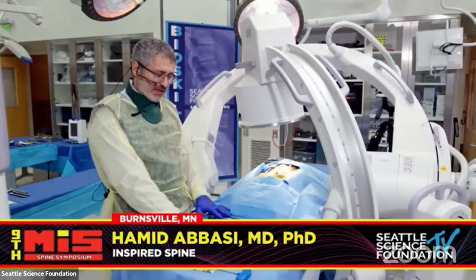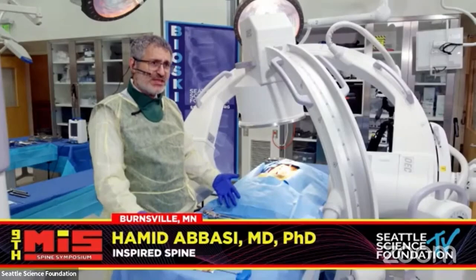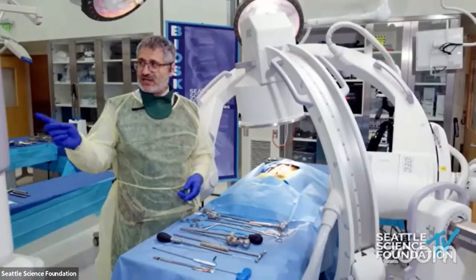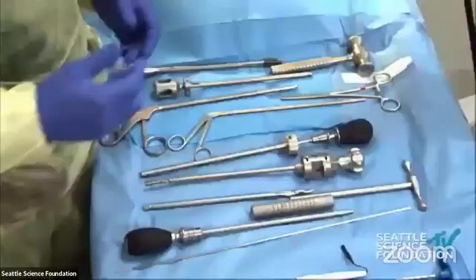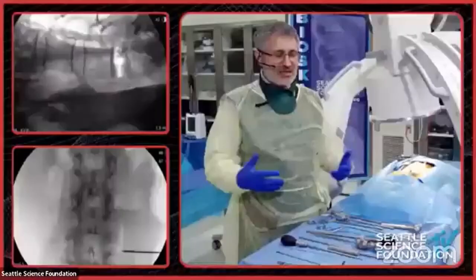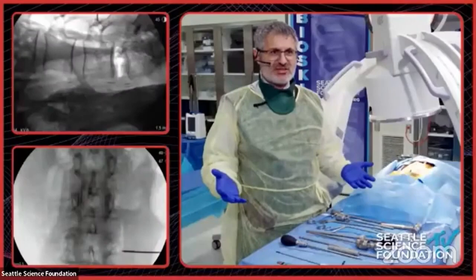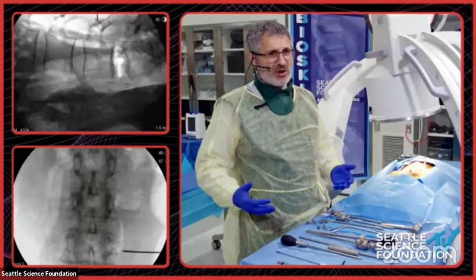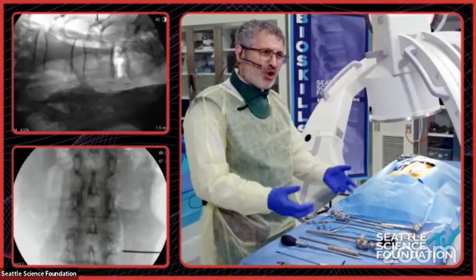I'm not sure if you can see my setup here, but if you take my name away, you will be able to see that what you see here is all I need to do the interbody part. I'm going to do the interbody part exactly the way I would do it in the OR. As you see, I have two C-arms that give me direct AP and lateral picture. The joke among my group is that we use the most advanced neural navigation machine, which is between my ears, and the most advanced robot, which is attached to my shoulder. We just have to work on the software to hone those skills.